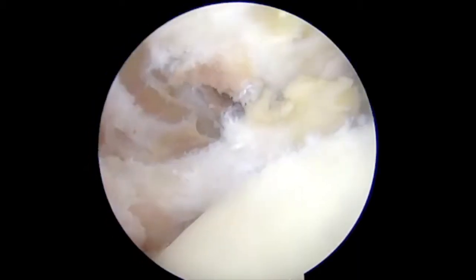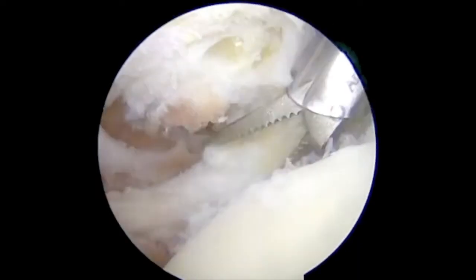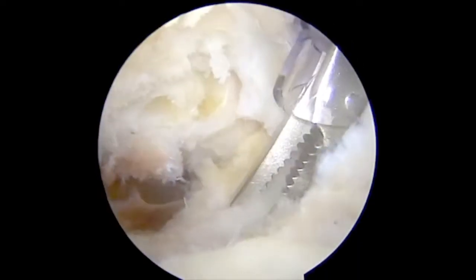An 8mm cannula is inserted through the anterior portal and an arthroscopic grasper is used to assess subscapularis excursion. A tear comprising 70% of tendon attachment is identified at the lesser tuberosity.